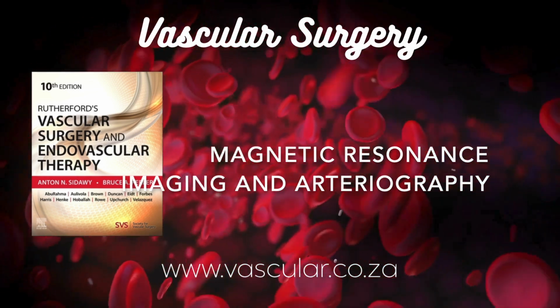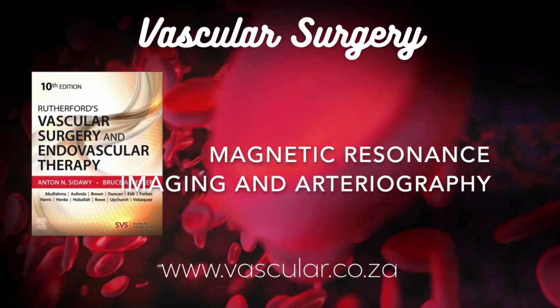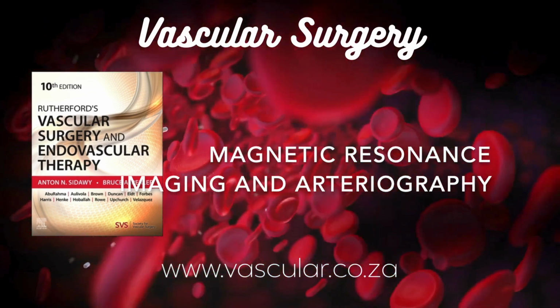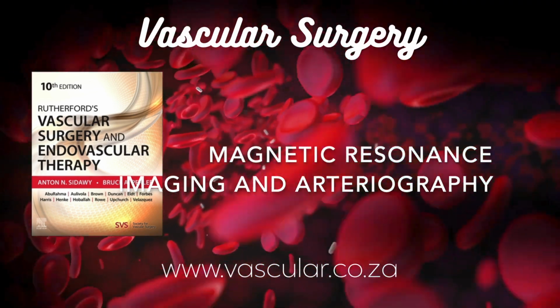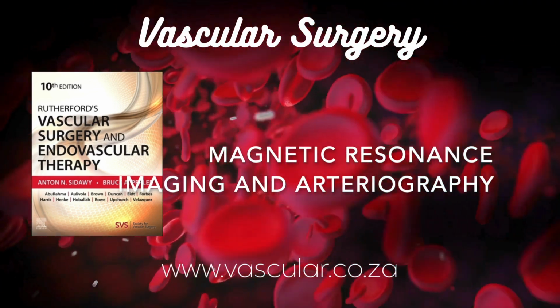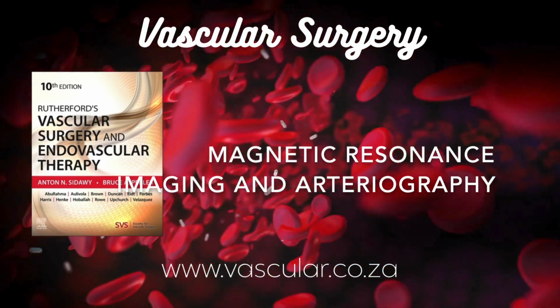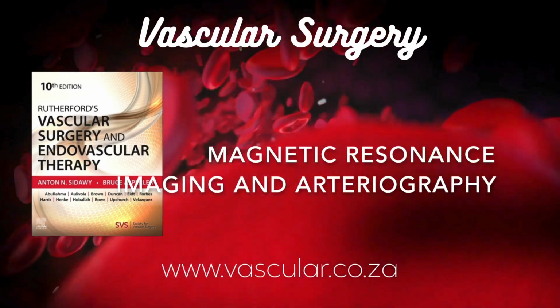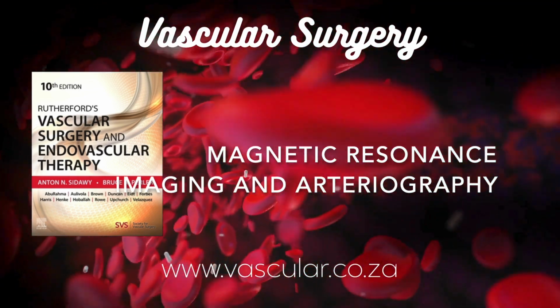That's really the foundation for MRA, isn't it? It absolutely is. At its core, MRI uses a really powerful external magnetic field, along with something called magnetic field gradients and also radiofrequency or RF fields. All these work together to generate signals from the tissues inside your body. And those signals become the image. Exactly. Sophisticated computers take those signals and turn them into the detailed images doctors look at.